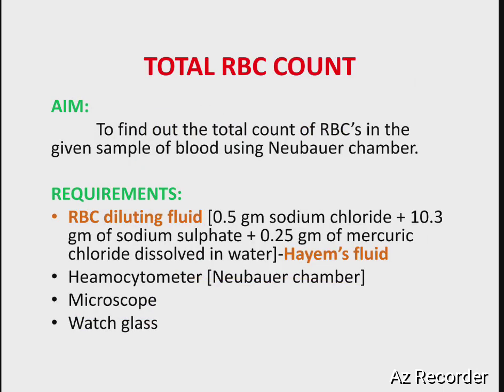Coming to the counting procedure, how can we simply count total RBC in the laboratory? We mainly use the Neubauer chamber for counting RBC.